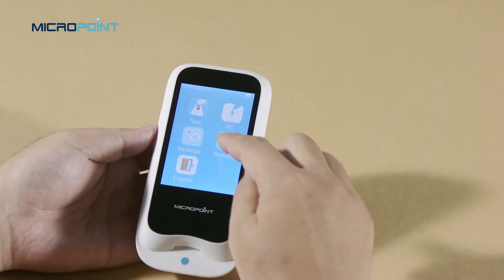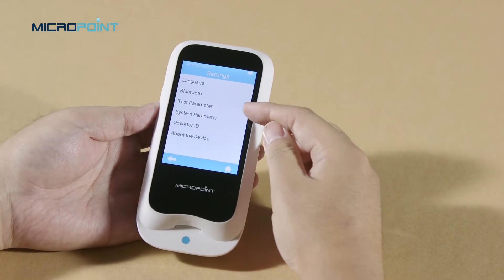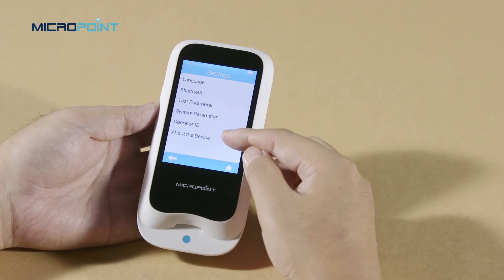Touch the setting button. You can change the Q-Labs Meter language, Bluetooth, test parameter, system parameter, about the device, and operator ID.